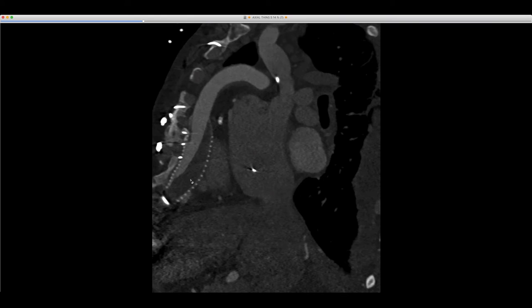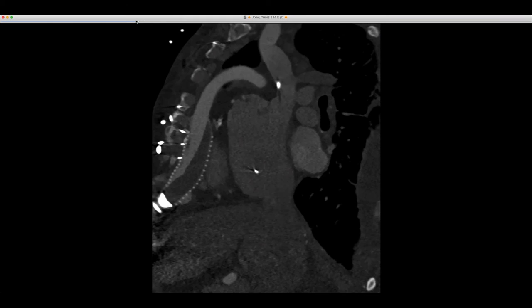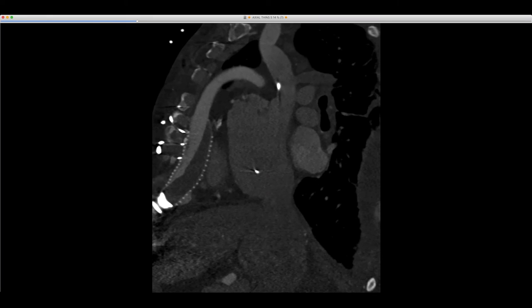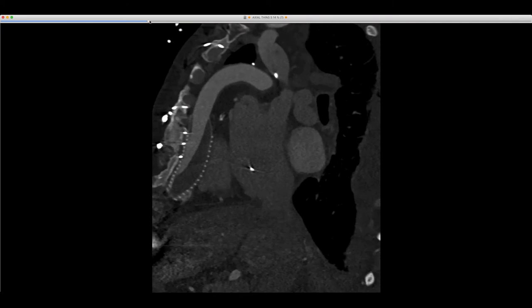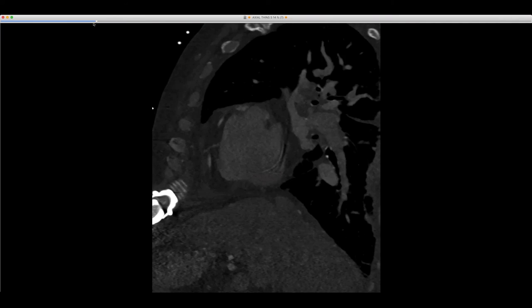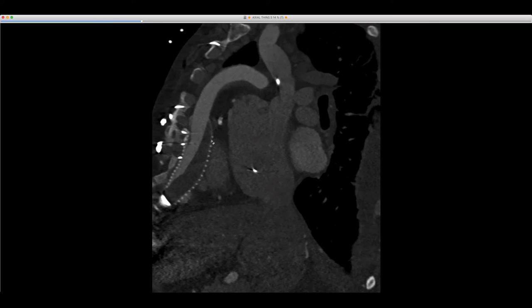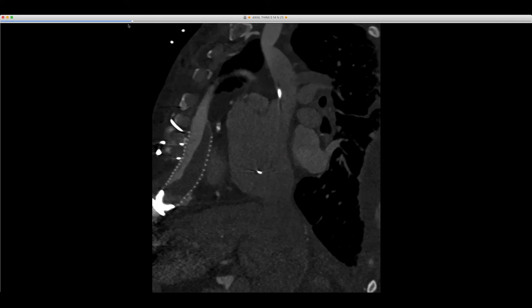But this is a case where clearly something more must have happened and more blood got in there, couldn't escape, congealed and narrowed the lumen, is what it looks like the more we look at this. Because it starts and stops right where the wrap is starting and stopping, and it has these margins here, we can see by virtue of the little rings how far that wrap goes, and that's the portion that contains the clotted blood under pressure. Right, that's what it looks like.